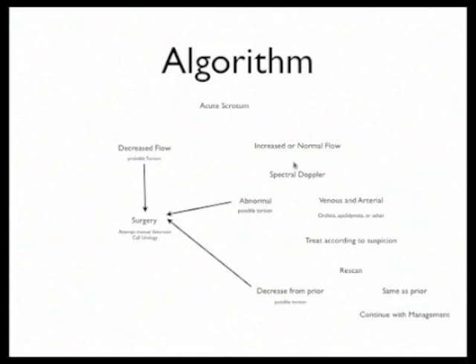Yeah, exactly. And that's a great point. You can just totally lump those patients into urology consult and radiology performed ultrasound. That's not really a problem. You're still going to catch a very large percentage. The highest percentage of these acute scrotums is epididymitis, so you're going to see increased flow. Actually, I shouldn't say that the normal ones are a minor percentage. Almost half of the patients in that study, 15 out of the 36, had normal ultrasounds of the testicle. So it is going to be a fair percentage, but you're still going to be affecting care in over half of your patients.